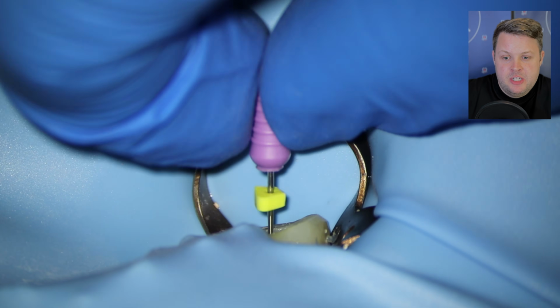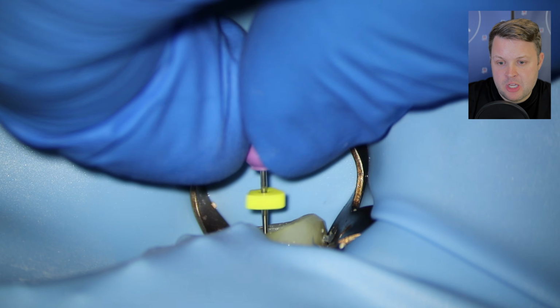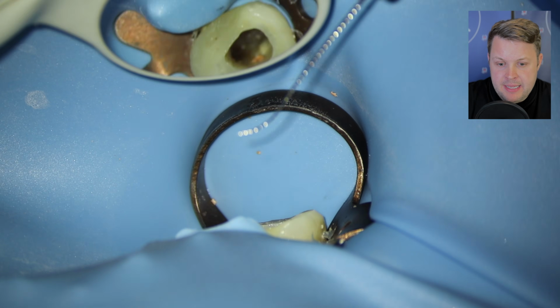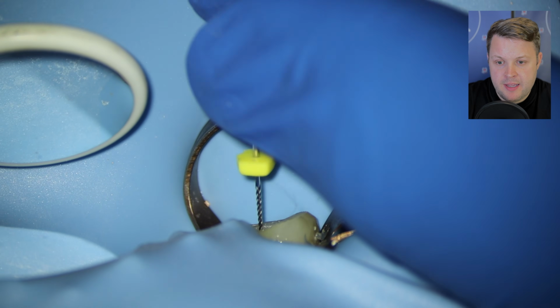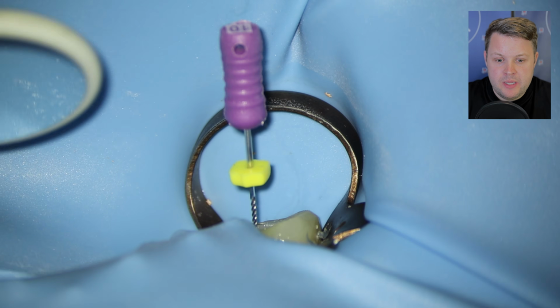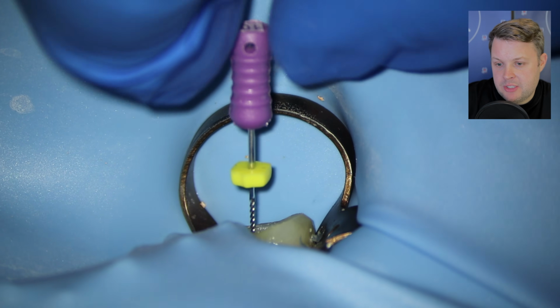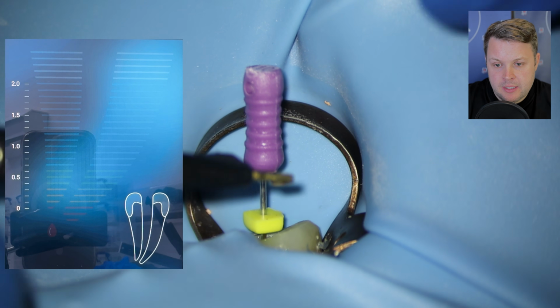And I know I'm not reaching zero because I know how far I've got, and this coincides with the rubber stopper. And again, making that little bend at the end with a size 10K file. And then as we hook up the apex locator, again, it's just not reaching zero. Really, really annoying.